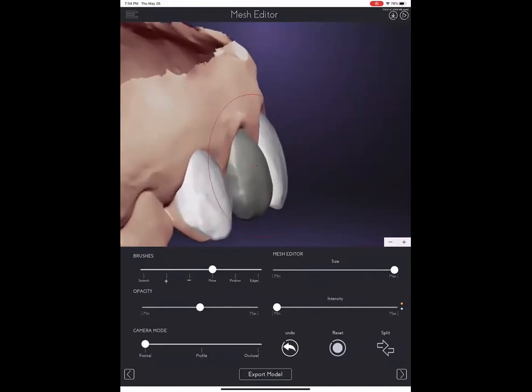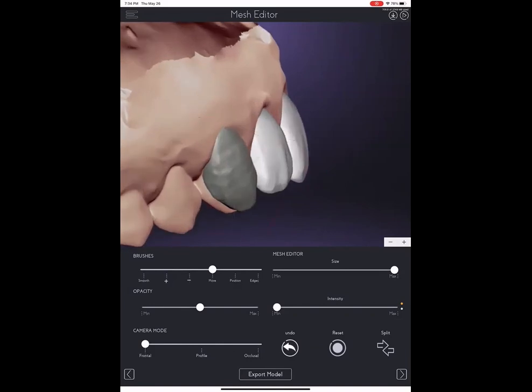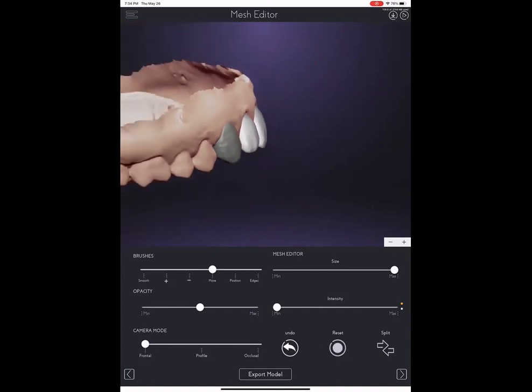I recommend you get a stylus, you know, that pen that has a little rubbery thing on the other end. You can get that. And if you're using a MacBook, I recommend you get a mouse, just because it's easier for you to maneuver the files, okay?